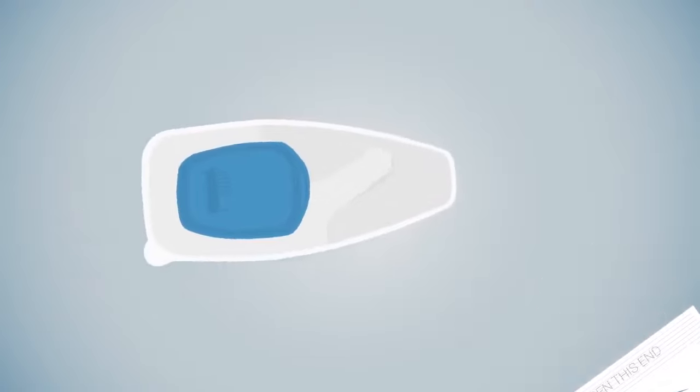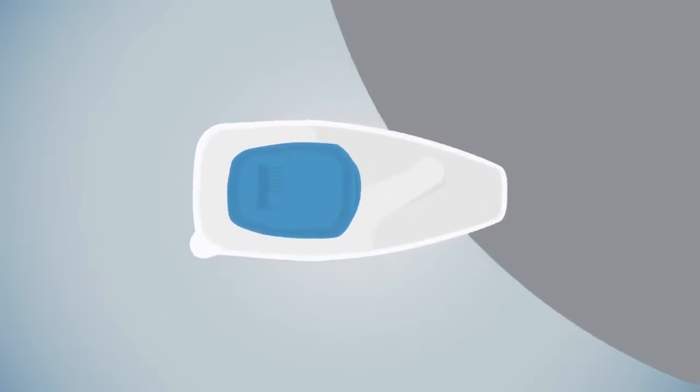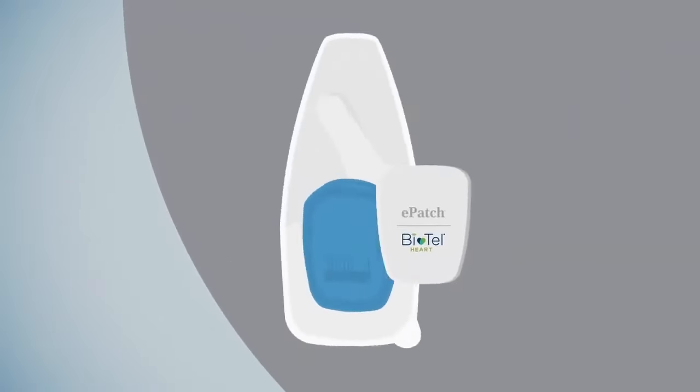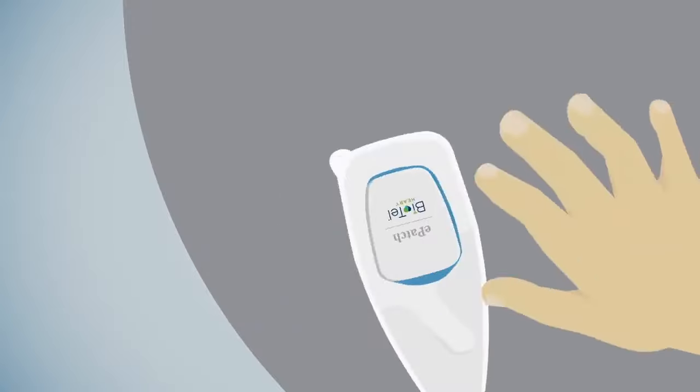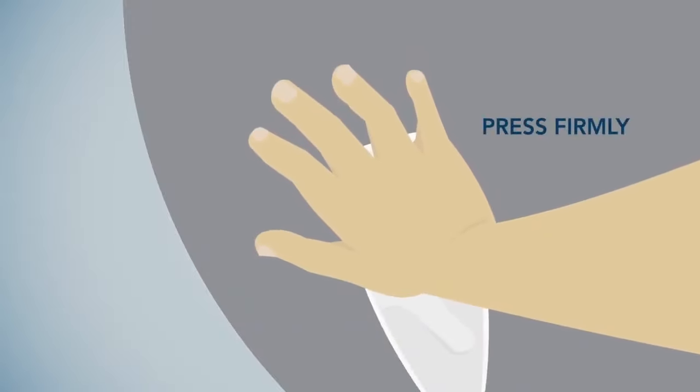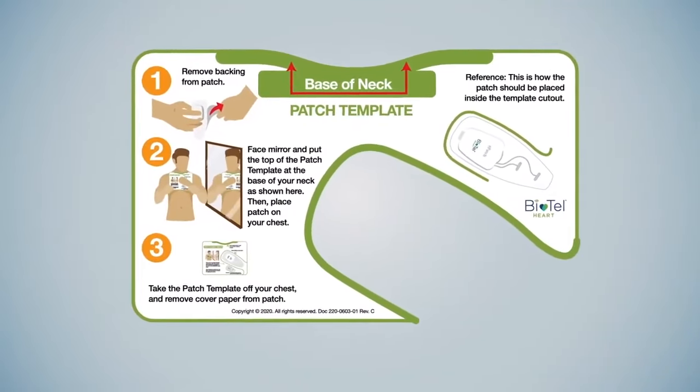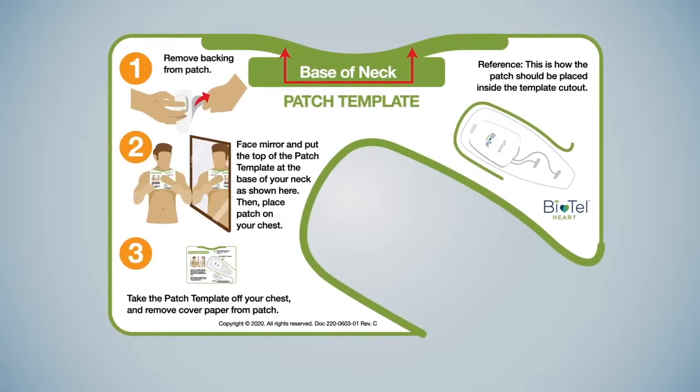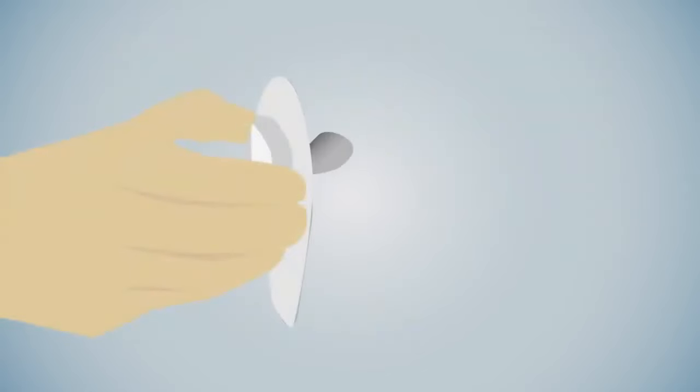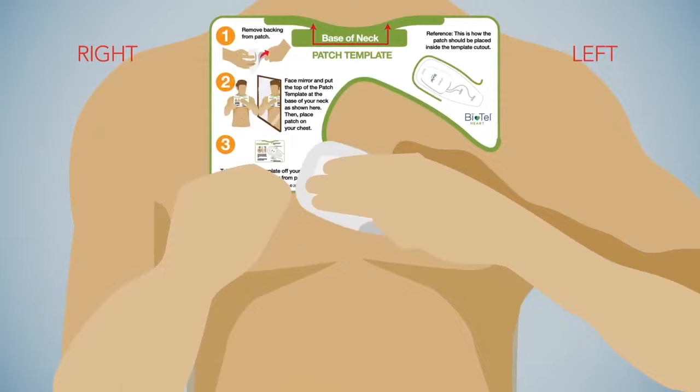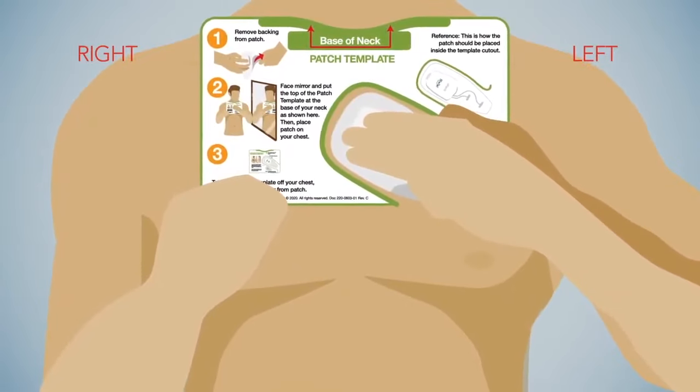Remove a patch from the patch pouch in your kit. Place sensor into the patch and press down firmly to snap it in place. Now, locate the patch placement template in your kit and follow its instructions for use. Remove clear backing and apply to your chest using the patch placement template as shown.